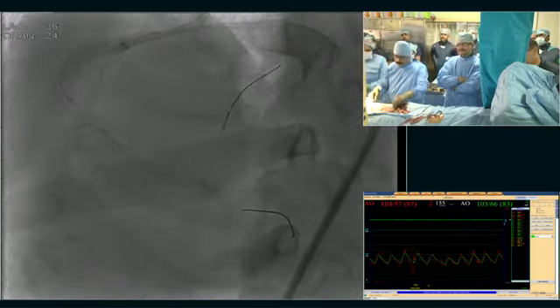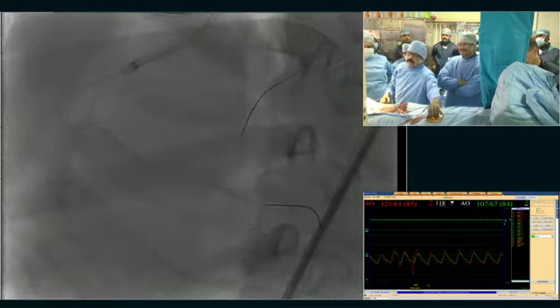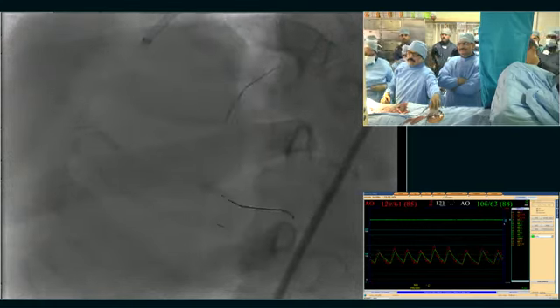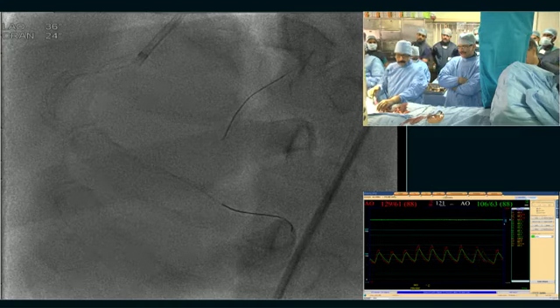So what will be your strategy here for the PLV? For the PLV, I will open with a Crusade catheter. You need to open the posterolateral branch. Absolutely. I think use the microcatheter, taking Crusade, and enter the PLV with the double lumen catheter.